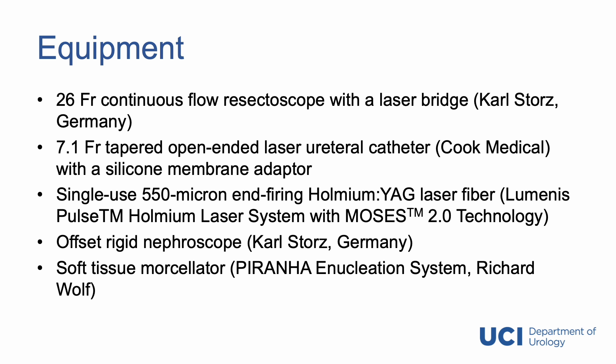For our equipment, we utilize a 26-French continuous flow resectoscope with a laser bridge. We use a 7.1-French tapered, open-ended laser ureteral catheter to stabilize our laser fiber. We use a silicone membrane adapter. A single-use 550-micron end-firing holmium laser fiber with MOSES technology is used for the case.